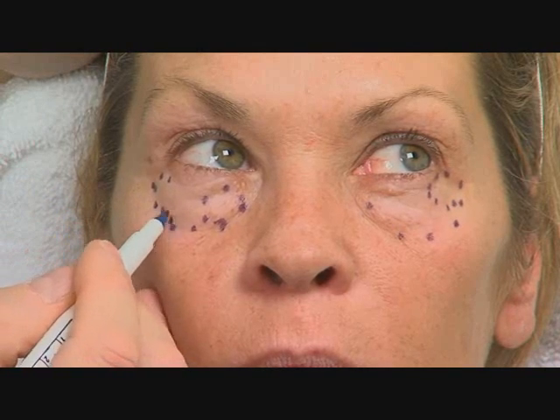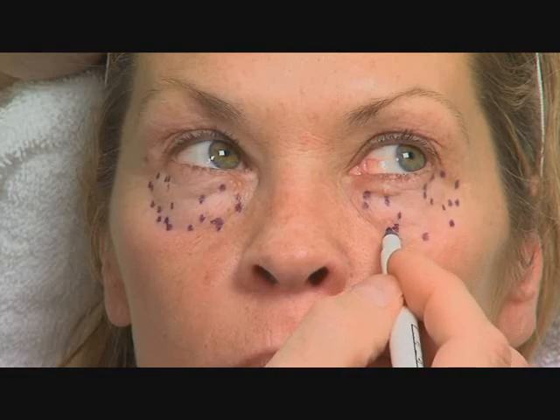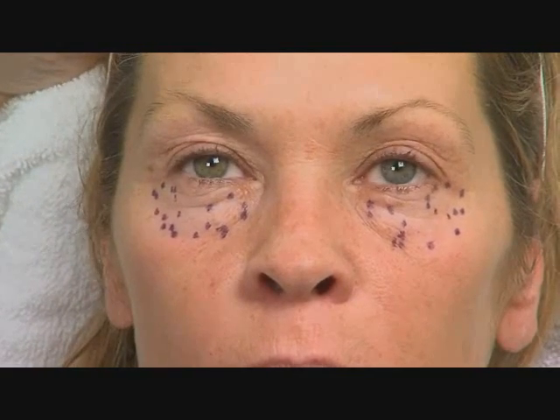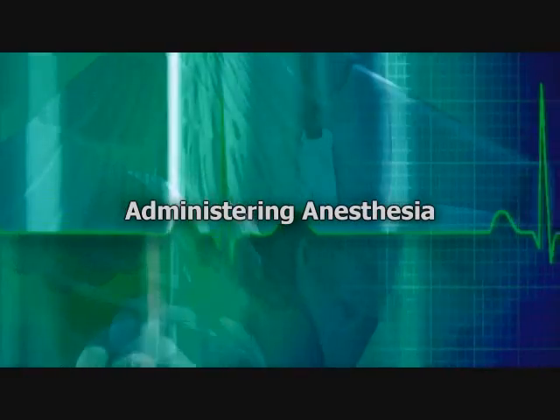Having the patient gaze in the opposite direction, upward and to the left, outlines the lateral fat pad on the right eye and the medial fat pad on the left eye. The space in between is the central fat pad. Laser energy must be applied to each of these fat pads in order to vaporize fat sufficiently and create the desired result.